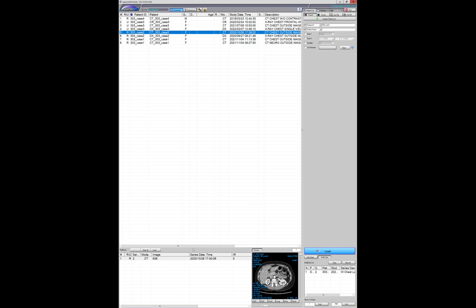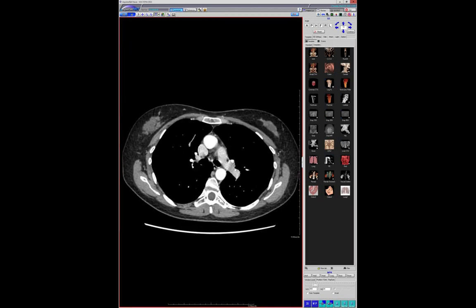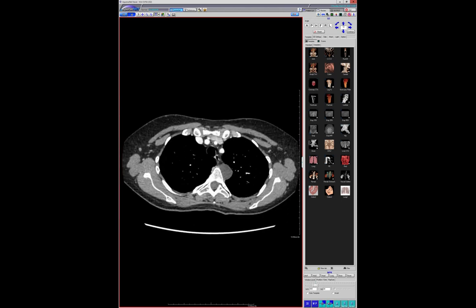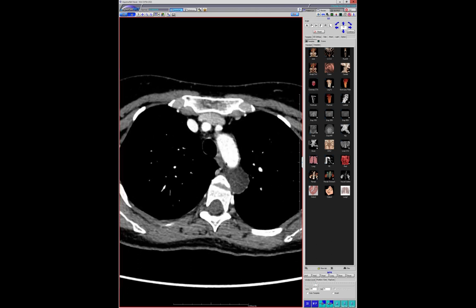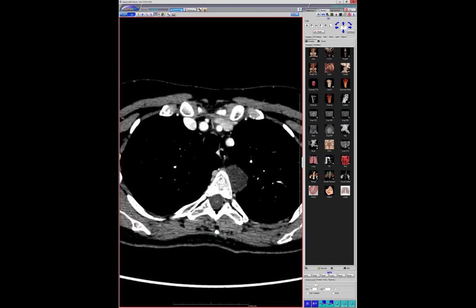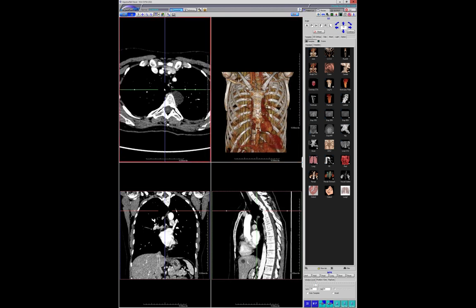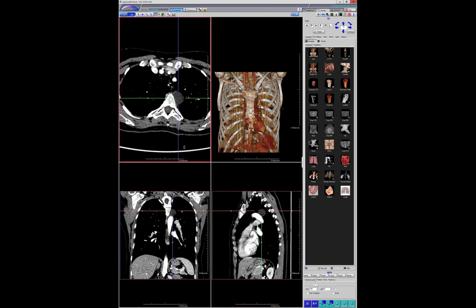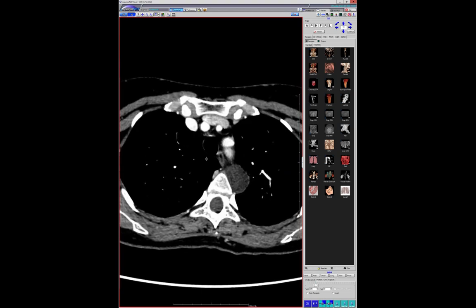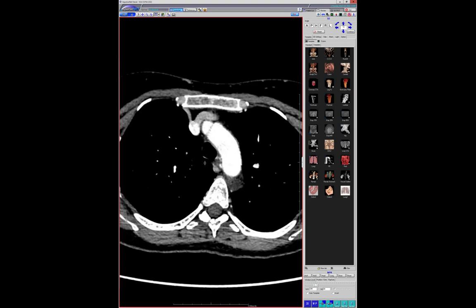The patient then had a CT. This was the lesion, and I was showing my fellow. He said it's low density, so it's going to be a bronchogenic cyst. I said no — a lot of the tumors of the peripheral nervous system, the schwannomas and neurofibromas, can be low attenuation on CT as well. Although this is quite low attenuation. Anyways, this was taken out and was actually a bronchogenic cyst.